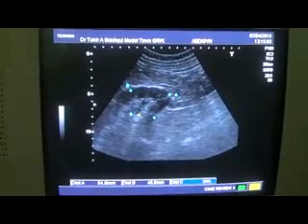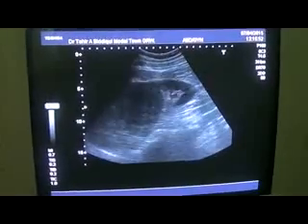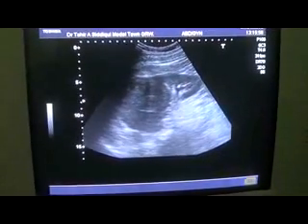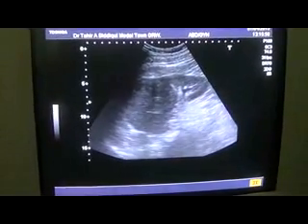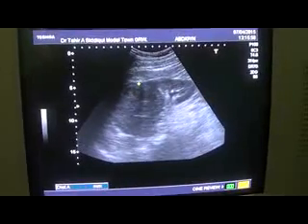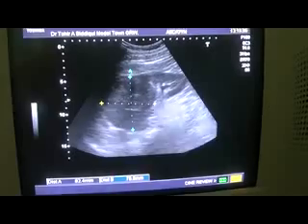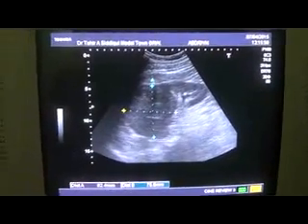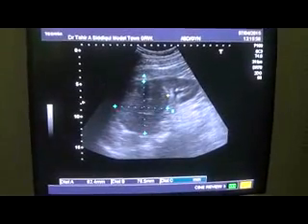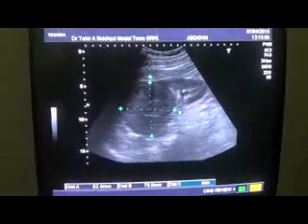This is the central sinus echo complex. However, the issue is that this is the actual pathology which he is suffering from. This is a solid heterogeneous mass, this area, with no posterior wall enhancement, measuring approximately 8.2 centimeter by 7.8 or 7.9 centimeter. It relates to the mid region of the right kidney and then the upper pole of the right kidney. It involves these two areas.